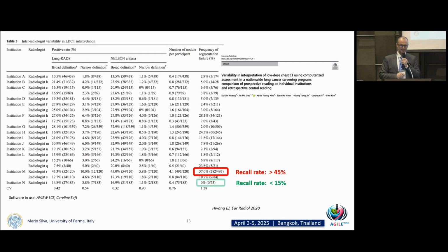The recall rate might vary consistently depending on how much the human is interacting with the segmentation. So the more we interact with the software, the farther away we get from the purpose of the software, to be consistent across time points and in inter-observer consistency. And yeah.